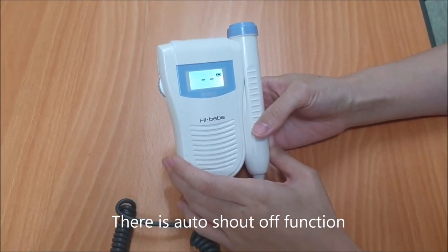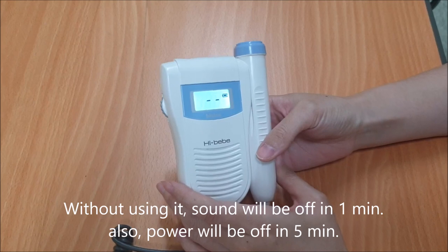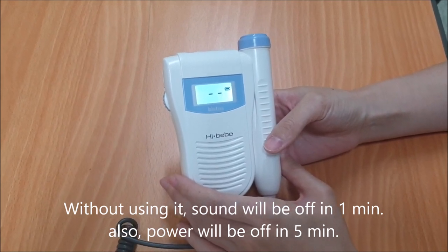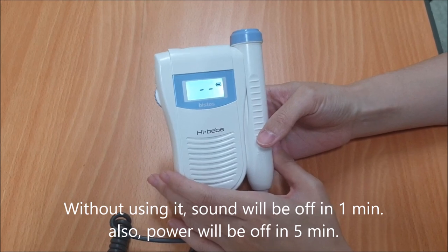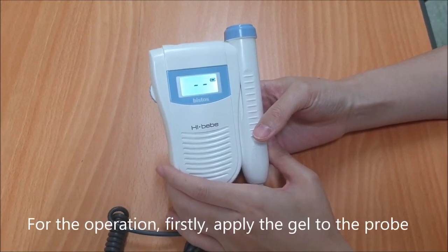There is an auto shut-off function. Without using it, the sound will turn off in 1 minute and the power will turn off in 5 minutes.